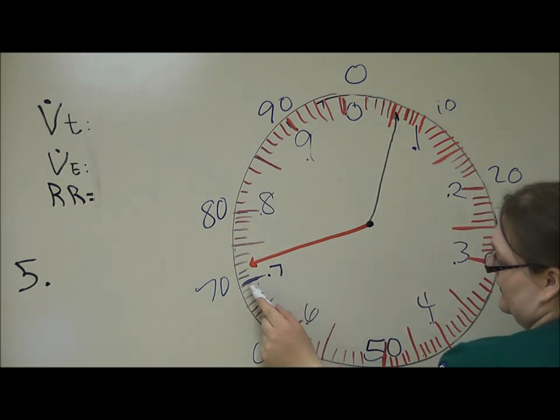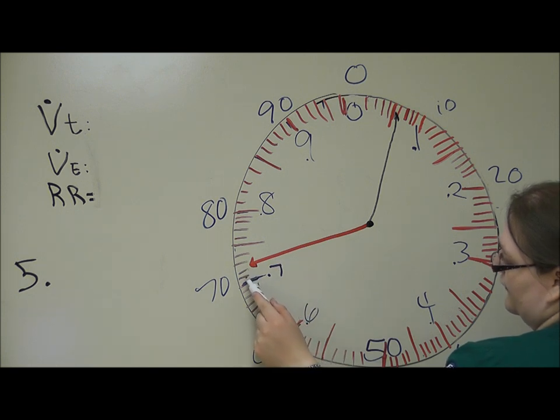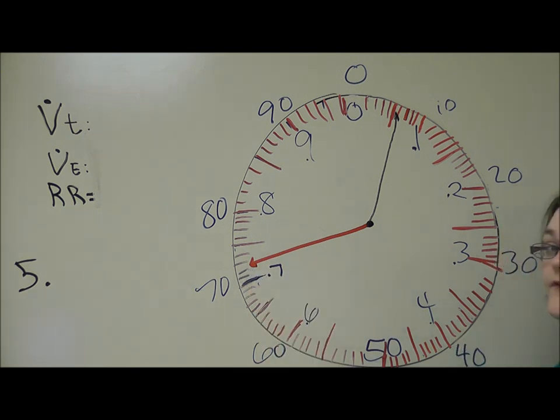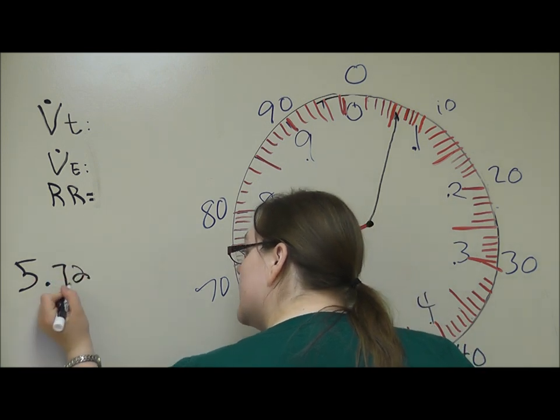5.7 down here. I'm going to say that this actually landed right on the 2 here. So this is .72, so 720 milliliters.